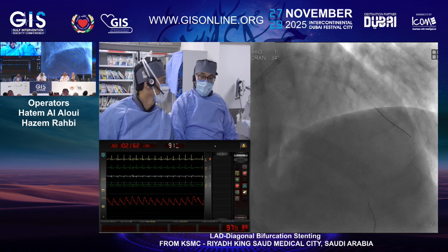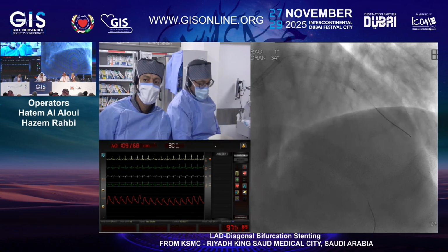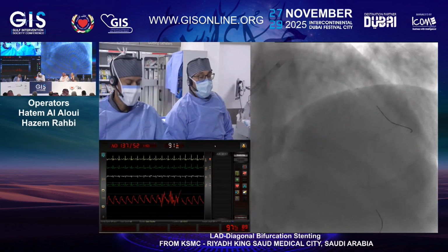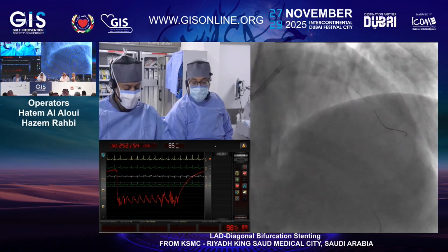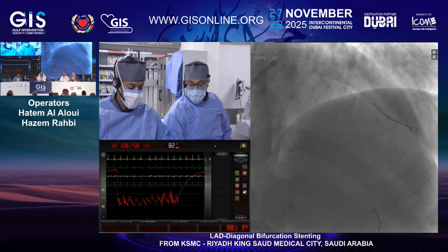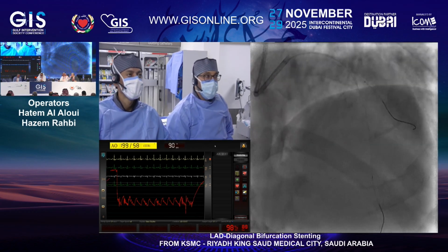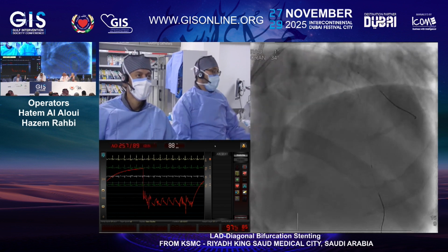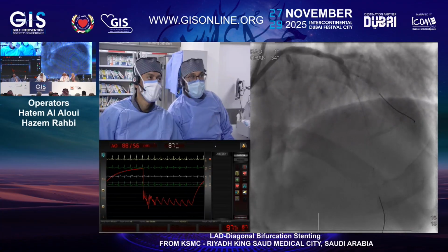I totally agree. According to the IVUS, in terms of length, if we are going to do a stent, I think 3.5 by 24 is probably fine. Any comments on that? The area was 10 at the ostium, so you can skip it and give the patient aggressive risk factor modification like PCSK9 inhibitors, and it would do the job.